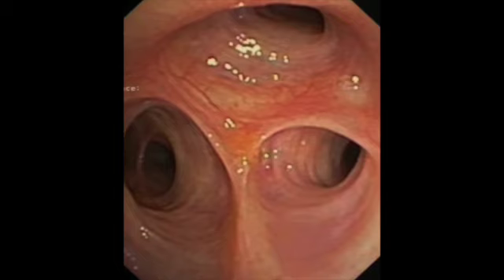At this point, some providers will choose to feed suction down the bronchial lumen in order to ensure that the left lung is fully down. At this point in time, you are able to listen to breath sounds, and the isolated lung should not have any breath sounds, where the ventilated lung will have breath sounds. However, the gold standard of placement is still going to be your fiber optic bronchoscope placement under direct visualization.